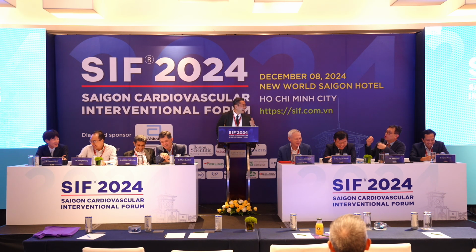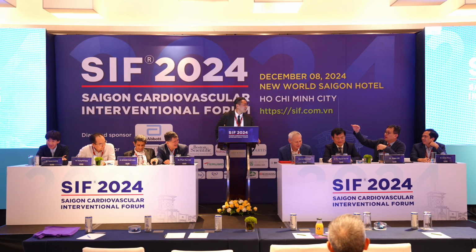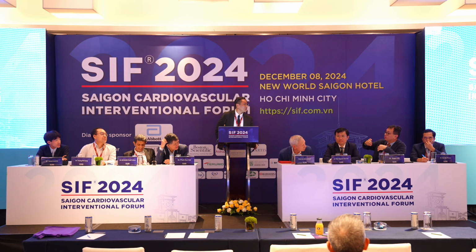But no, I'm curious. When you start with a 1.25, do you then test with a balloon to see whether it can expand? How do you choose to stop? Let's say you do a 1.25 and then you do a 1.5. Is it worth testing with a balloon at that point to see whether it expands?